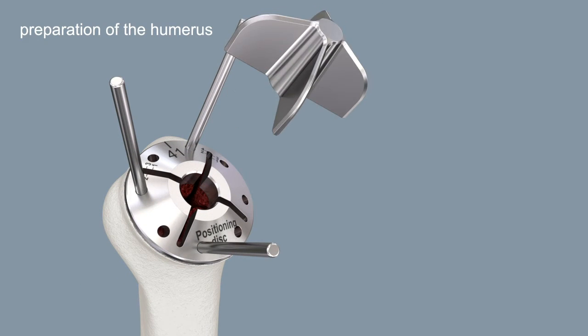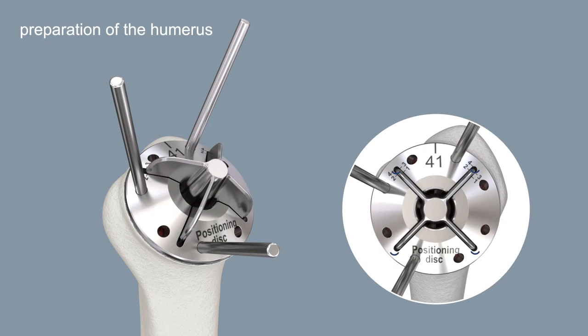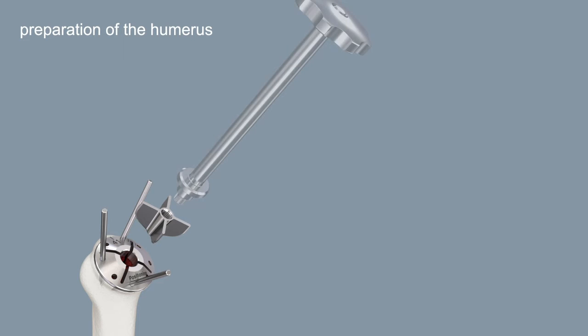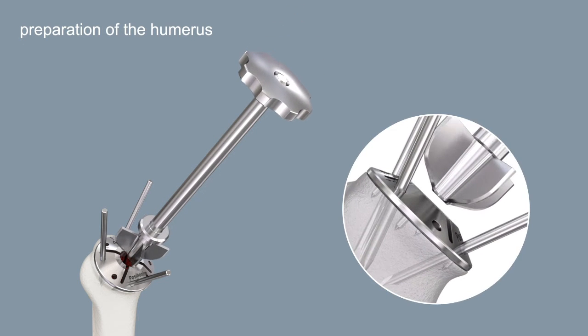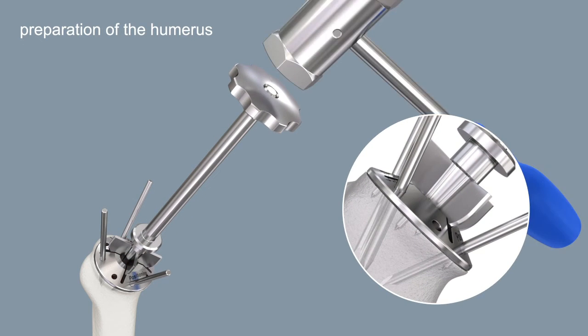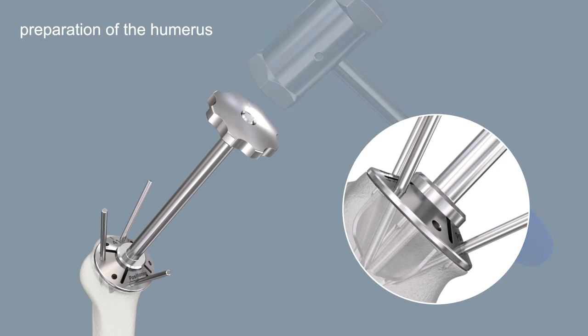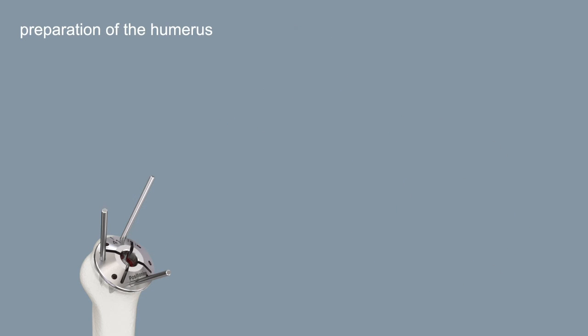Place the stem impactor upside down in the slot of the positioning disc. A distance of 3 to 5 mm to the inner cortical border is recommended. Drive in the selected stem impactor until the stopper is completely flush with the positioning disc. Unscrew the positioner and remove it together with the 3.2 mm pins and the positioning disc.